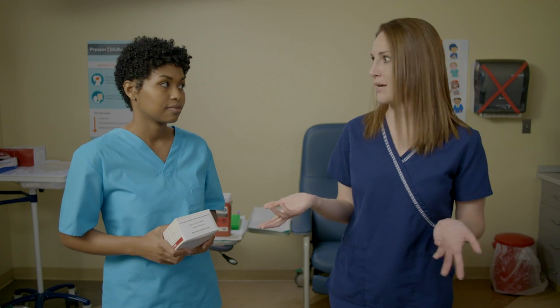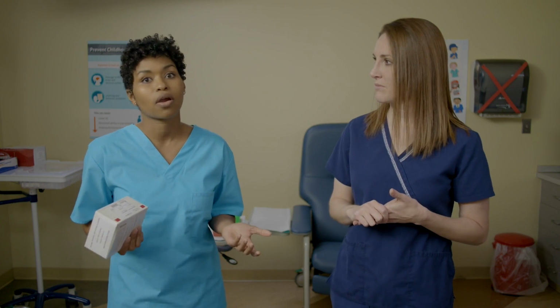Anything the patient's blood comes in contact with needs to be lead-free. Which begs the question, what do terms like sterile or lead-free mean on a Vacutainer box or a Lancet package? Lead-free may or may not mean lead-free enough for our current reference level. And of course, sterile does not mean lead-free. So if it just says sterile, that's not going to cut it.